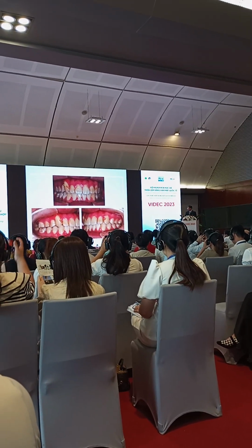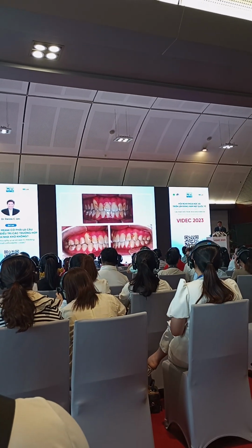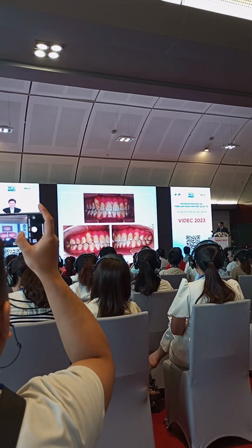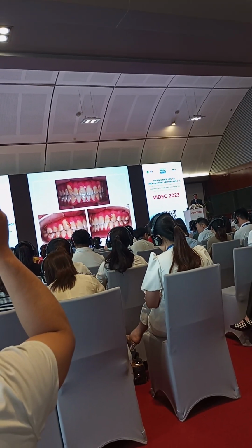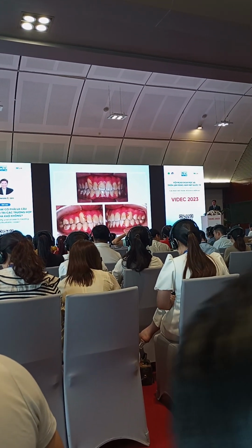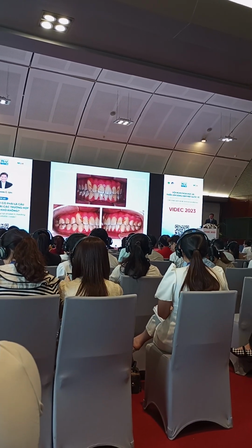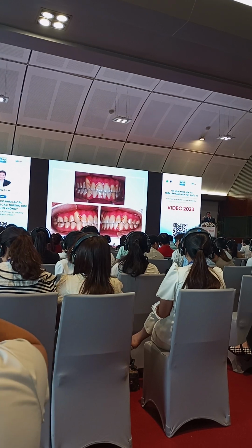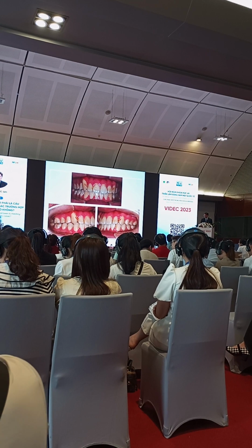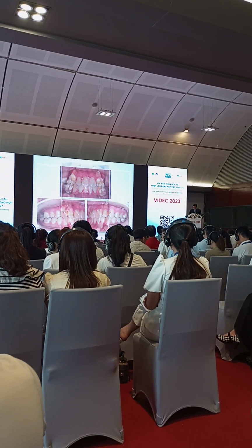I could have torqued the root more lingually if I had the chance now. Then I could probably reduce a little of the recession of the gingiva, but during that time I did not do it. So if I were to do it again, I will probably do more torque on the canine, just to improve the position of the canine. So this is the occlusal view.